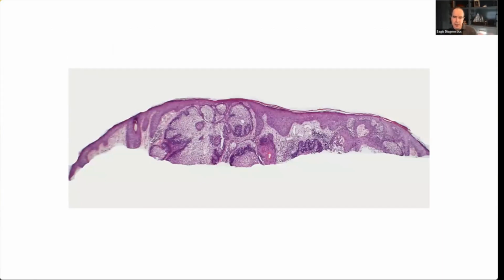So we're faced with a sebaceous neoplasm in an older patient, let's say on the face. And this one would end up being called a sebaceous adenoma, but you can see sebaceous adenomas in patients with Muir-Torre. So the question is, do you want to screen for it or not? And we won't get into the algorithms for that, but I will show you how we would do this. So it was decided to screen for Muir-Torre.